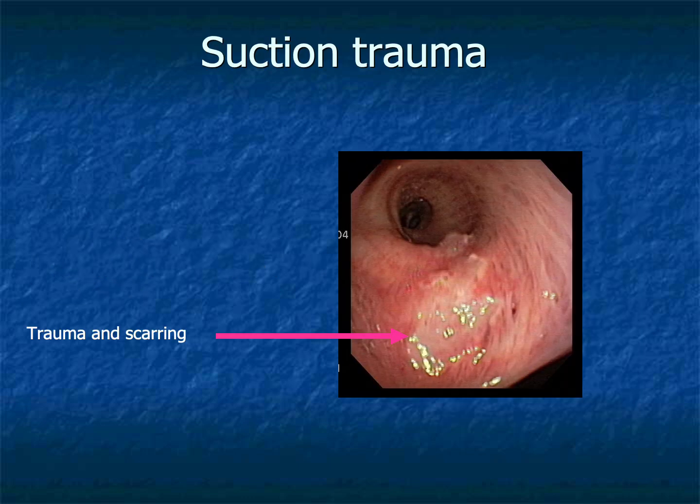Bronchoscopic manipulation itself may produce airway injury. Suction trauma commonly appears as localized erythema, mucosal abrasion, or small areas of hemorrhage. Recognition of procedure-related changes is important because they may otherwise be mistaken for disease.